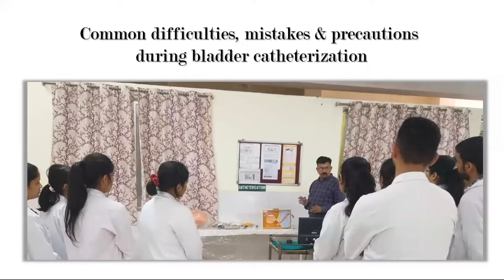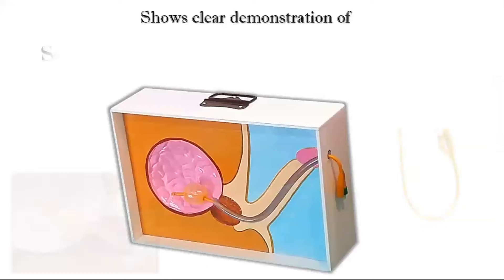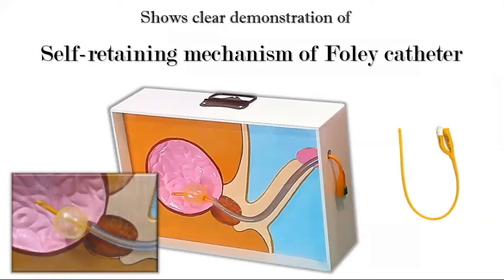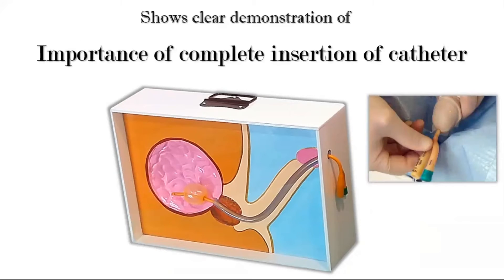This model has been specifically designed to teach students about the common difficulties, mistakes, and precautions during bladder catheterization. For example, you can teach your students exactly where the balloon of the catheter is and how the self-retaining mechanism of the Foley catheter works.